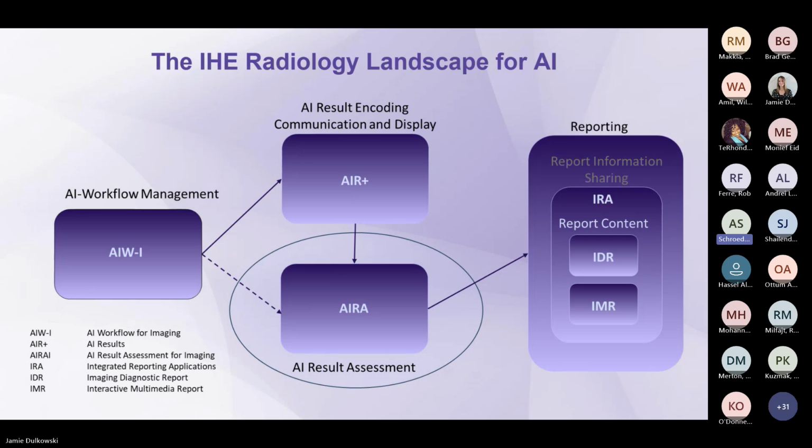And then we have profiles managing the actual report content or the information of the report, information sharing, like the IRA, which does the FHIR-based communication of AI results, or could do. And then we have the content profiles, which actually define how the actual radiology report may look, either in an interactive multimedia report or in an imaging diagnostic report. Next slide, please.